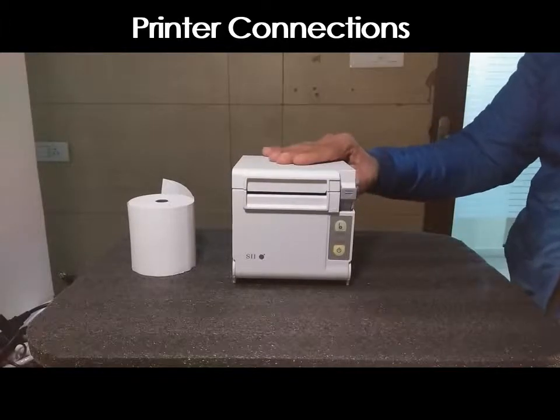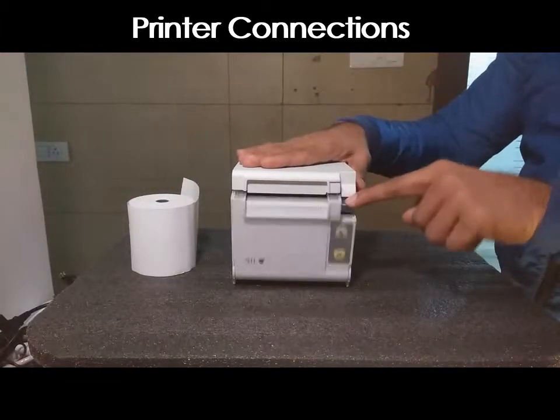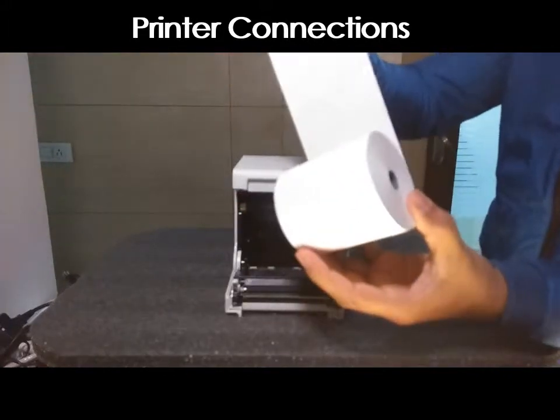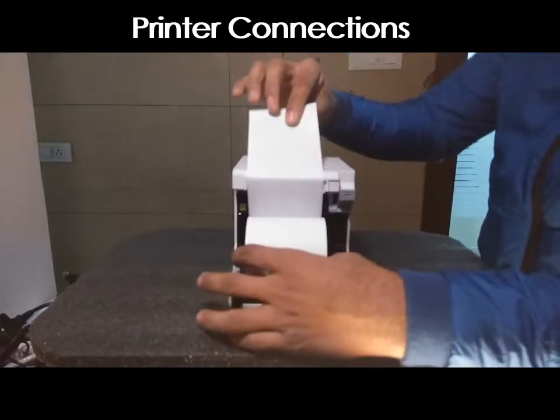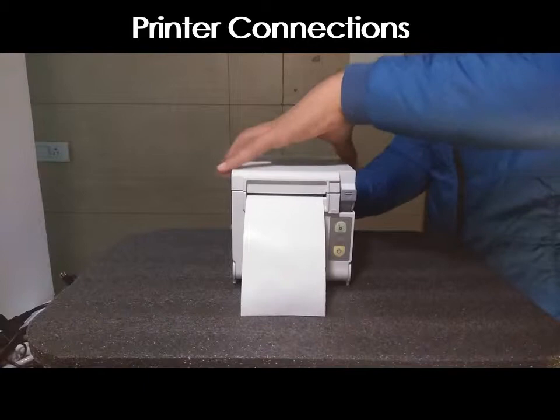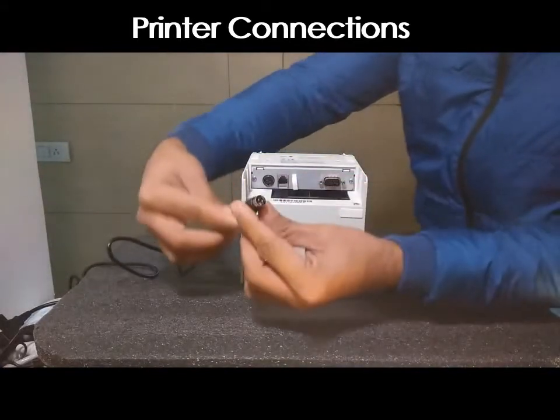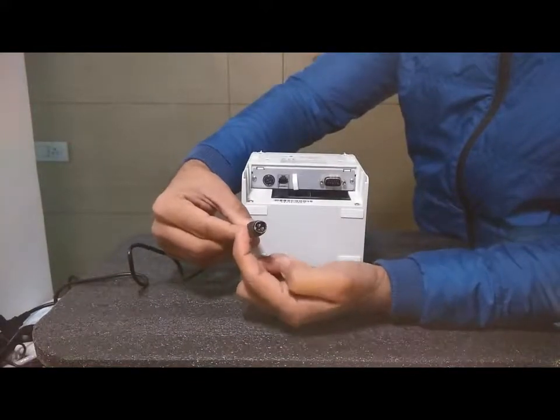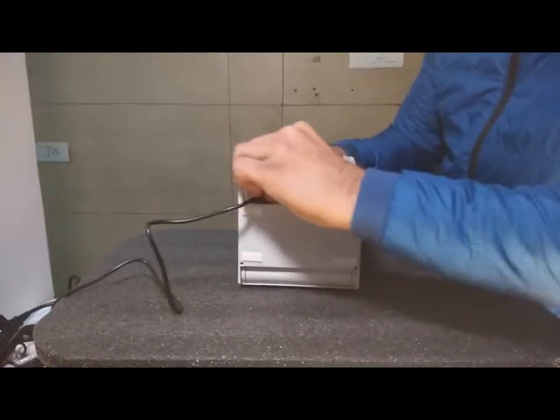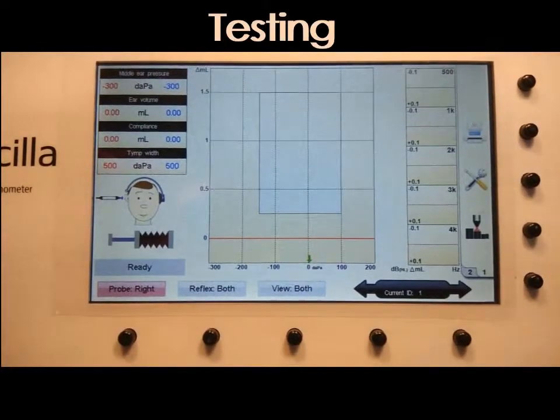Now we'll set up the thermal printer. This is the paper roll we use to print the test. Press the button to open the lid of the thermal printer — you will see an indication inside showing how to place the paper. Place the paper inside, leave a little bit of paper outside, then close the lid — it will make a sound indicating it's locked. Connect the power adapter to the printer, noting there is a flat surface on the port so place it downwards when connecting. Once connected, turn on the thermal printer.